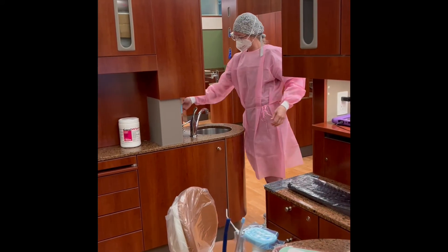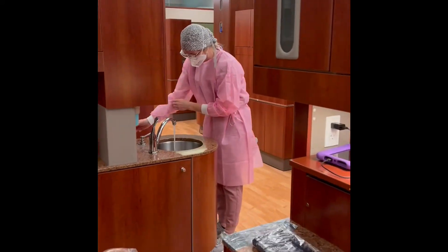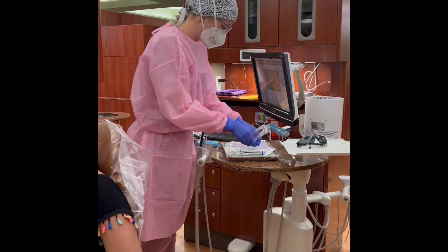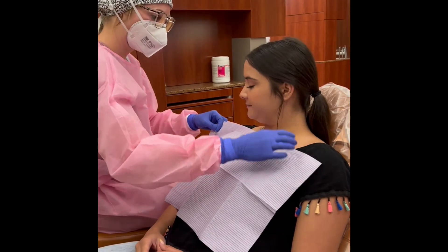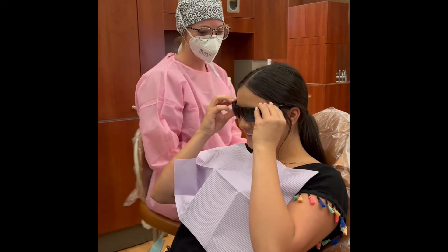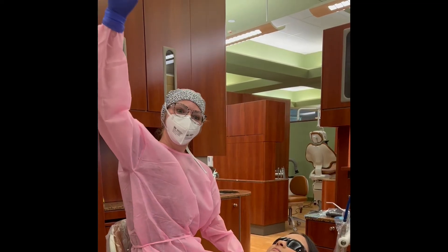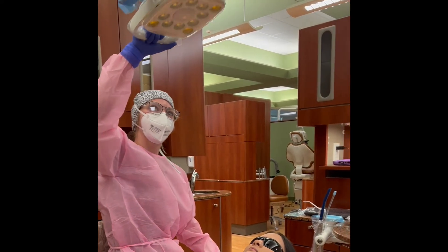Remove contaminated gloves, complete hand hygiene, and don clean gloves for the intraoral exam. Give the patient safety glasses and lay them back for the intraoral exam. Adjust the dental unit light so that the oral cavity is well illuminated.